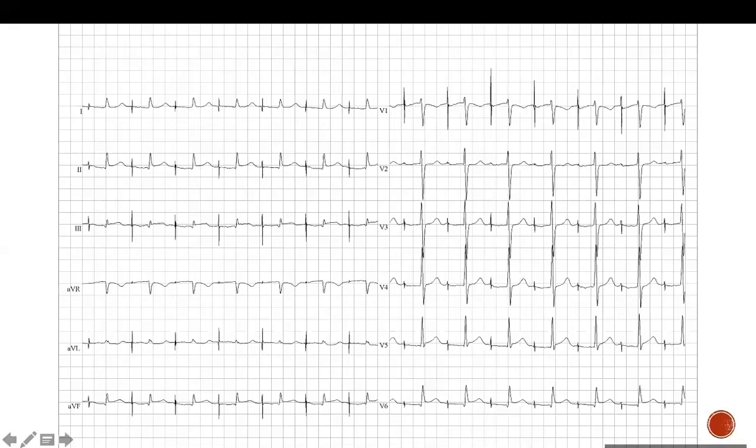Does anyone have a question? Doctor Lamia, isn't the distance between the atrial pacing and the ventricle prolonged? So okay, there is first degree AV block. So what? That's why we try to make things as physiological as we can. If this is dual chamber pacing, we want to avoid ventricular pacing, because ventricular pacing has its disadvantages. It causes cardiomyopathy, could cause symptomatic pacemaker syndrome. So you try to avoid that and keep as much intrinsic conduction as possible.